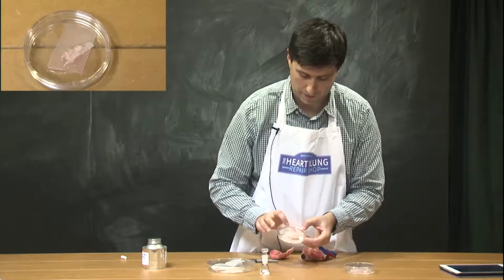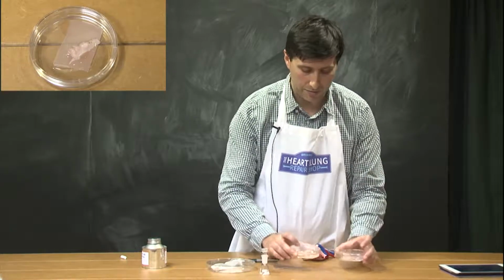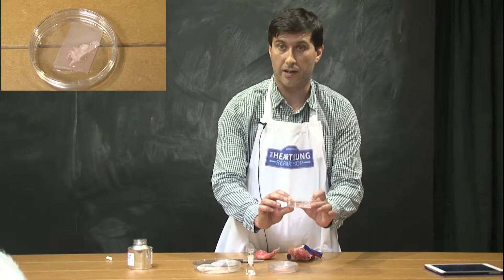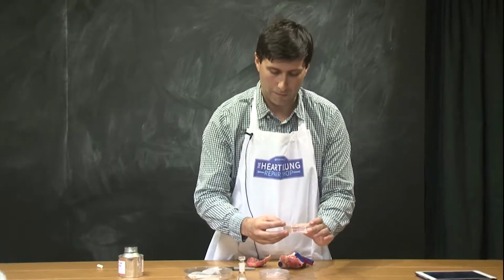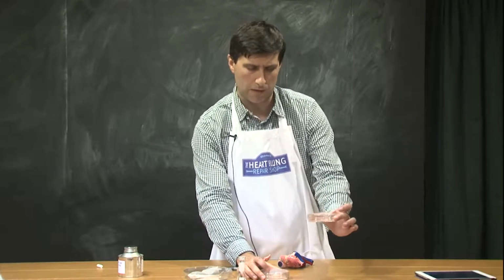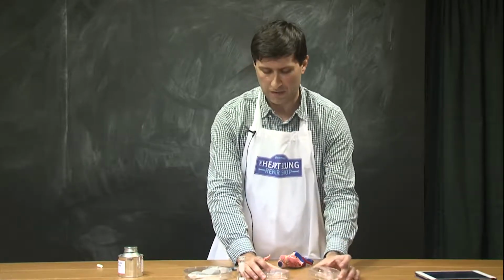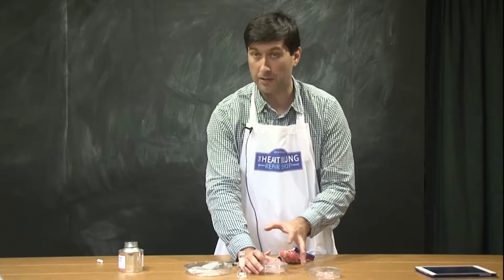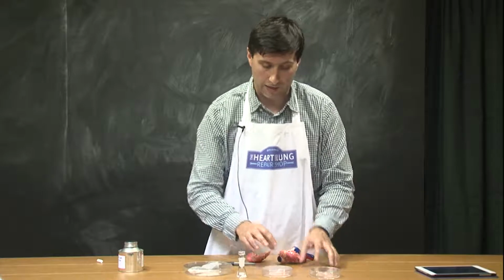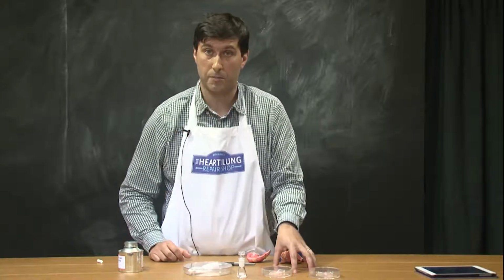And this is the mitral valve. What's very interesting about these valves is that people don't realize how thin they are. They think they are much thicker, but they are very, very thin material, probably about 1 millimeter for the aortic valve on average, and the mitral valve is slightly thicker than that. But even though they are so thin, they can withstand the high pressure present in the blood.